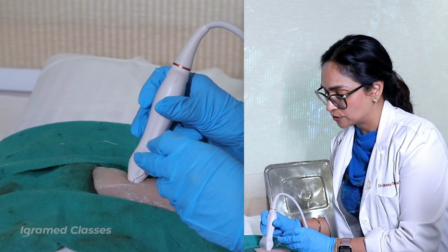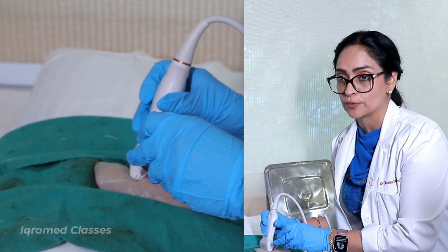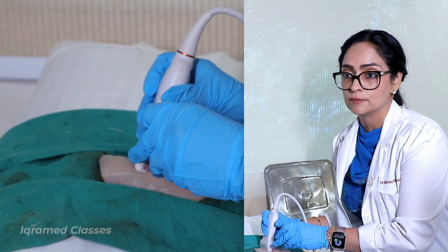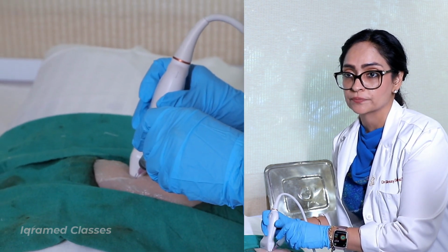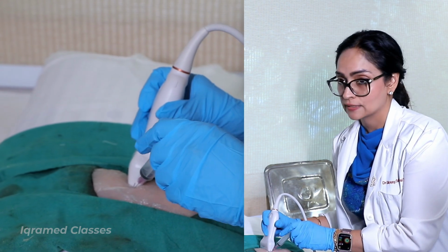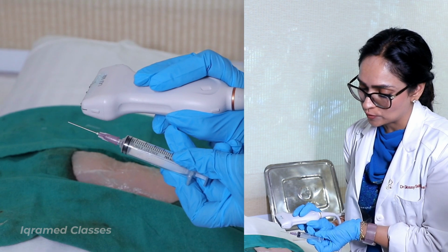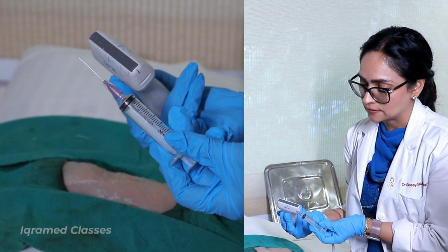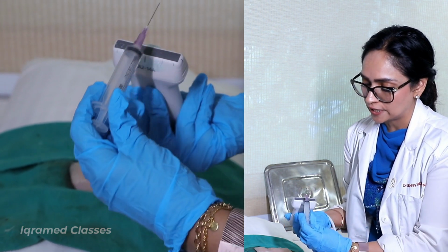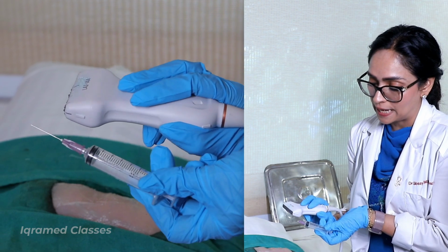Now this is my probe and I am going to insert it. First I will just do a little prick so that I know where I am. Do a little movement as you can see on the screen also, and then go straight in. Now in this way my needle and the probe is parallel. But if it is not parallel to this, if I do like this, this will come end on. But I have to keep it parallel to this.